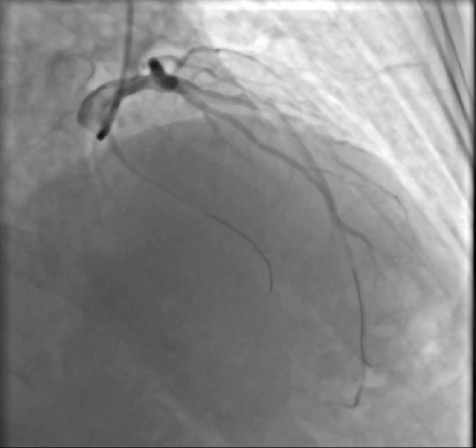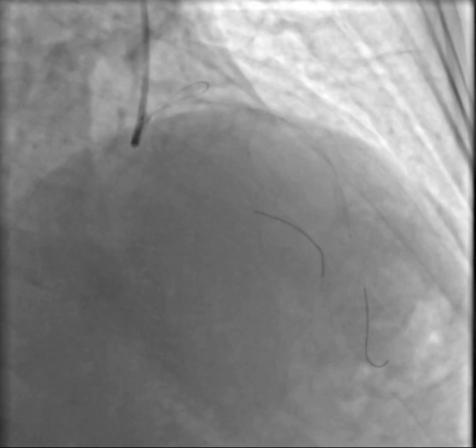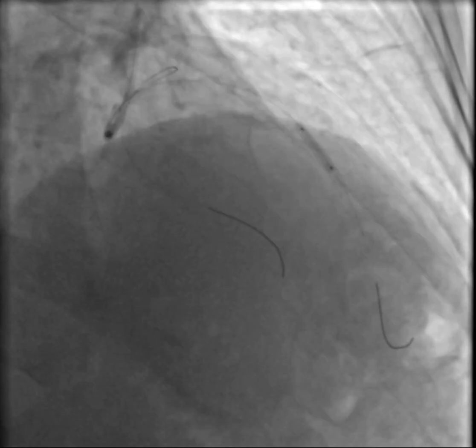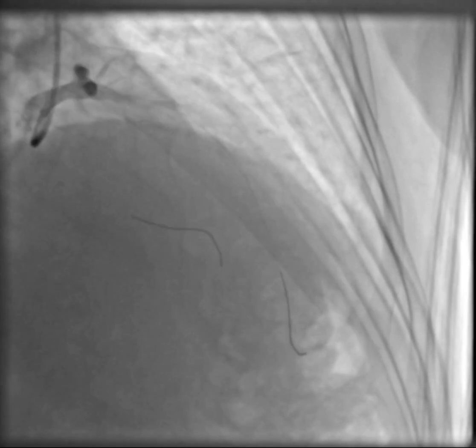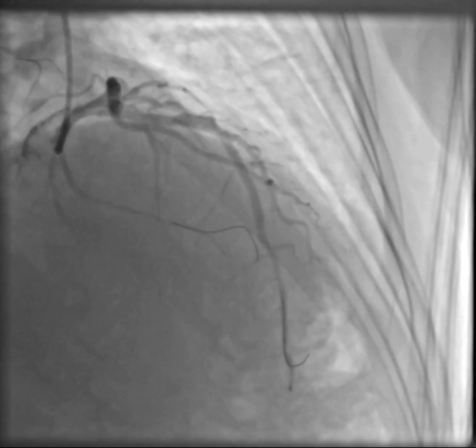On the subsequent injection, you can see that post-dilation is required. As I mentioned in the previous video, the balloon dots should be positioned within the stent, which you can also observe here. In this image, we used IC to better visualize the balloon position. After the injection, you can see how nicely the LAD is opened.